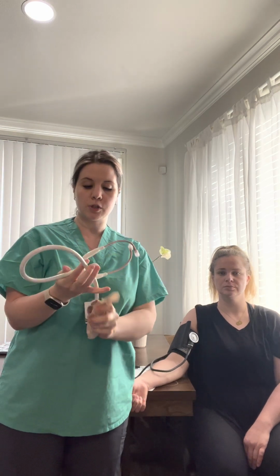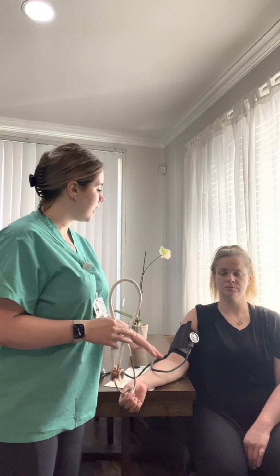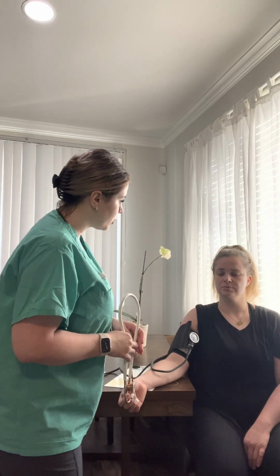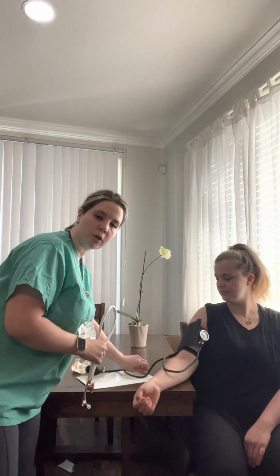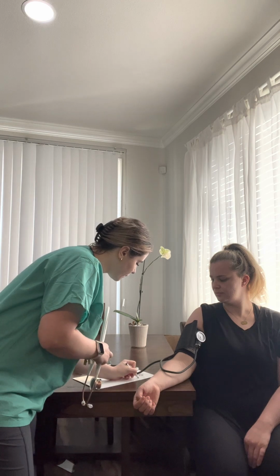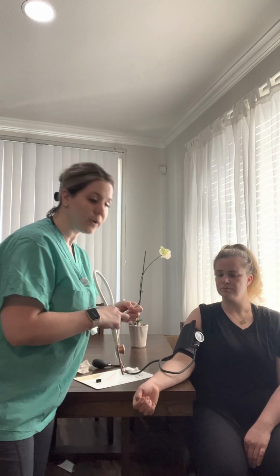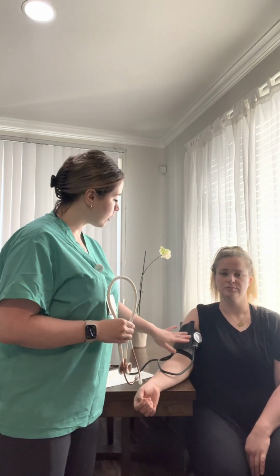Once our stethoscope is sanitized, we're going to ask our patient what their typical blood pressure is, if they're aware of that. I just wanted to make sure, do you know your typical blood pressure rate? 122/80. Perfect. So we're going to write that down. Now that we know the patient's typical blood pressure and her systolic is 122, we're going to pump our valve 30 millimeters over that, which will be 152. So we're going to assess her blood pressure.